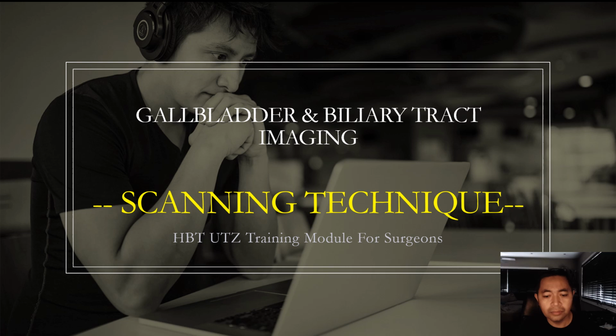Welcome to the scanning technique section of our training module. Here we will tackle the technique involved in locating, evaluating, measuring the gallbladder and the biliary ducts.